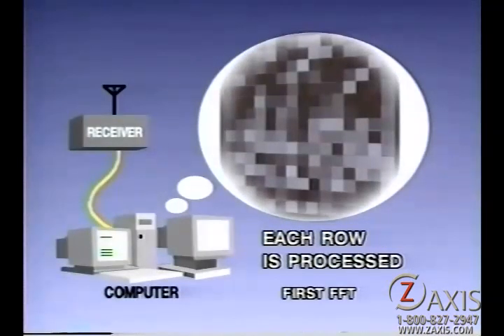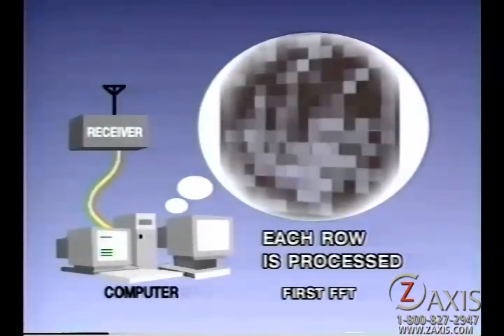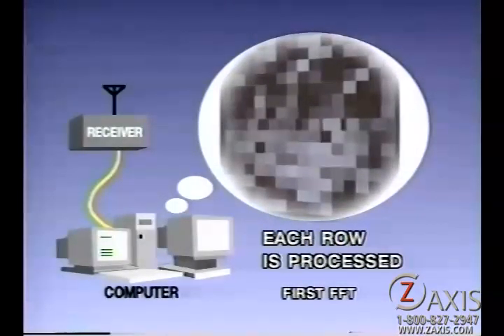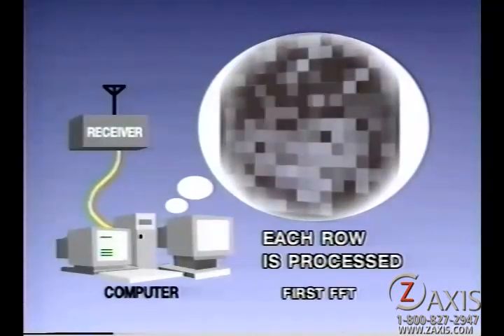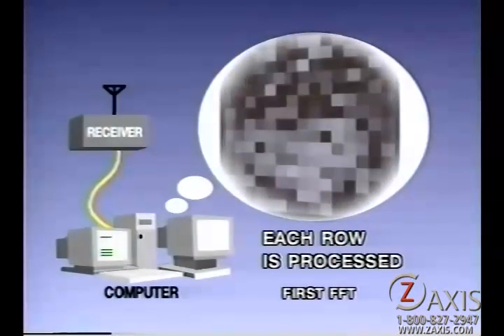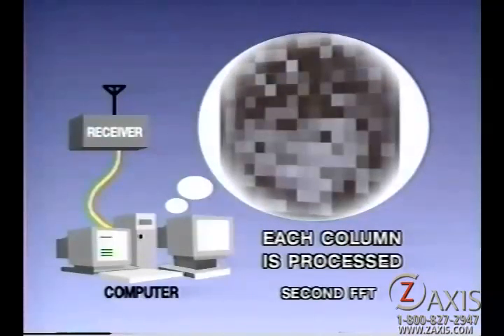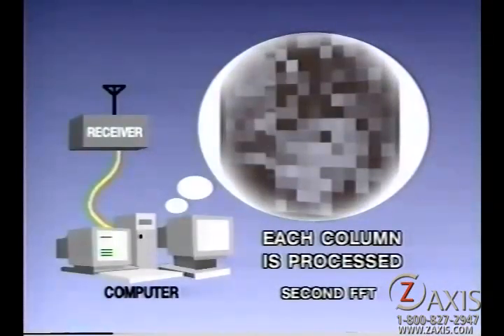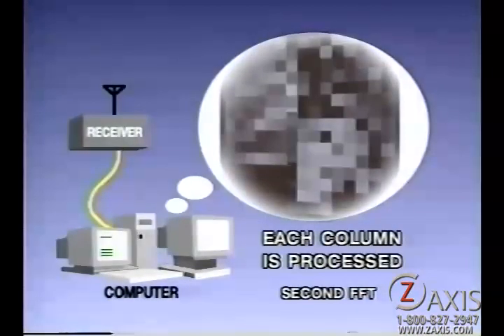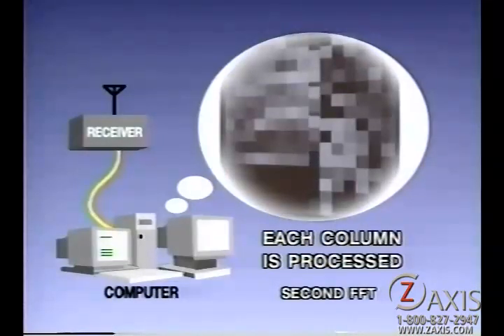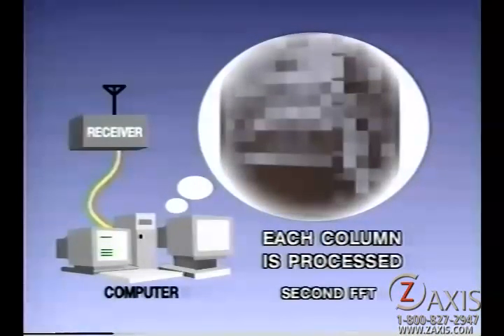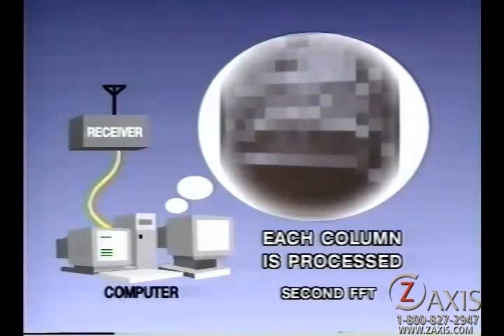First, the computer processes each row of pixels using a mathematical algorithm called a fast Fourier transform, or FFT, to arrange the blocks in the correct horizontal position. This makes use of the phase information that was applied to the protons with the first magnetic gradient. Then, the computer processes each column of pixels using another FFT pass to arrange them in the correct vertical position. This makes use of the frequency information that was applied to the protons with the second magnetic gradient.